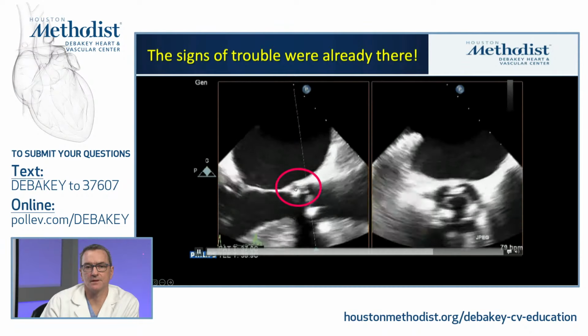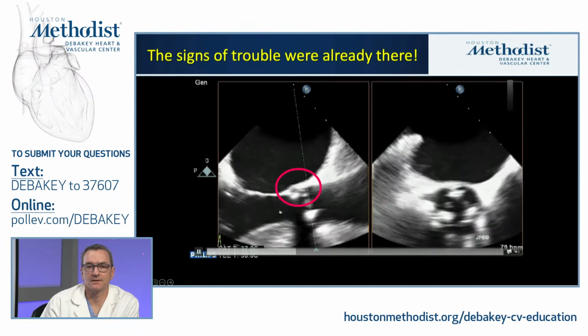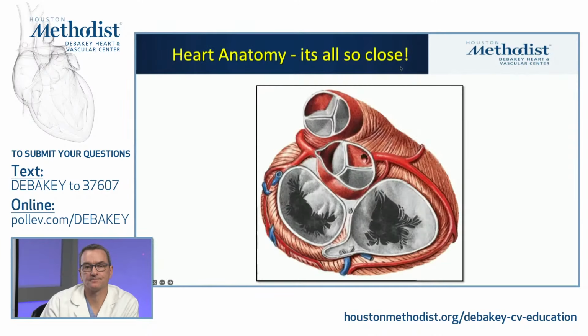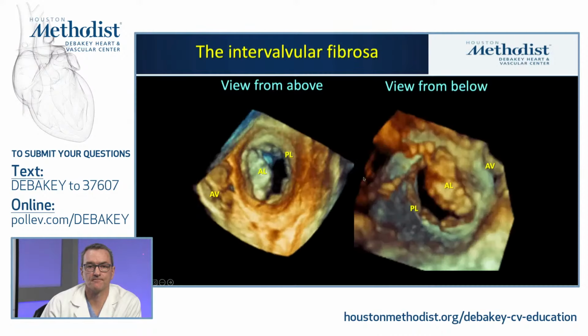So that's one of the things to be aware of. It's very common to have periprosthetic abscess, even small, and that has to be really what we're looking for in addition to any immediate valvular effect of infection. So this heart anatomy is all very close. For example, the pulmonic valve is nicely separated, but the other 3 are very close to each other, share a lot of common tissue from the left and right fibrous trigone into the septal tricuspid leaflets, the anterior mitral leaflet, and all 3 of the aortic cusps.